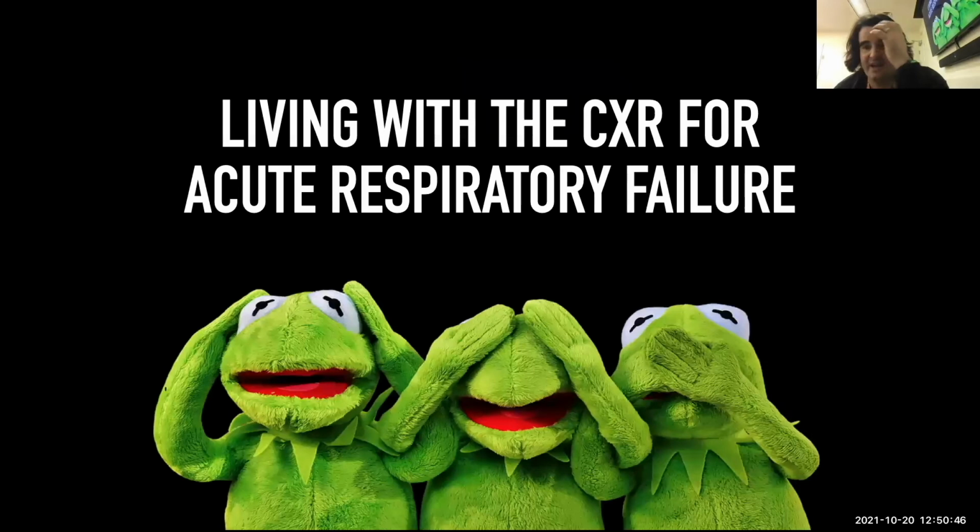That's one thing that I obviously want to prevent, and I think we should all try to prevent that. But this can happen when we use X-rays and then point and shoot once the X-ray is interpreted. So I do think it behooves most of us to use ultrasound to clarify what these problems truly are to prevent these kinds of harms.